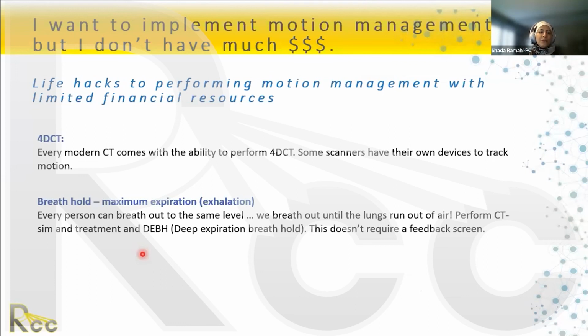And you could do, I don't want to make this too trivial. It sure does require a little bit more physics involvement, of course, but you still need to capture this level of breath hold. Maybe do a homemade box with reflectors and you have a camera and then you need to be able to see it. I cannot recommend that for a homemade device, the therapist press the beam on and off if the signal falls below the window. I cannot recommend that, but I've seen it done. However, I would caution against it, right? So there's some life hacks.